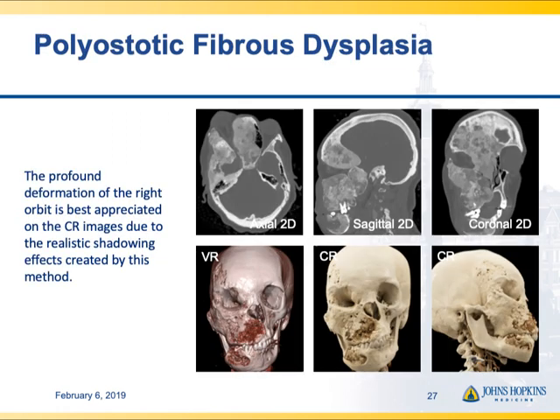This is a sad case of polyostotic fibrous dysplasia — a very deforming process — where the patient was losing vision in her right eye. The cinematic renders really show how profound the deformity of the right orbit is, and with realistic shadowing effects you can really see how shadowed out the deep part of the orbit is, helping you understand the effects on the optic nerve causing vision loss.